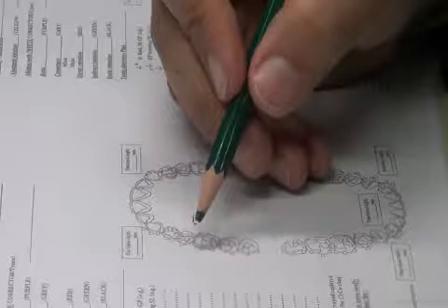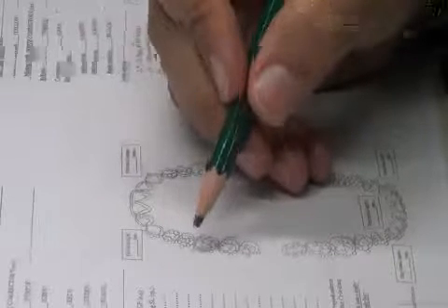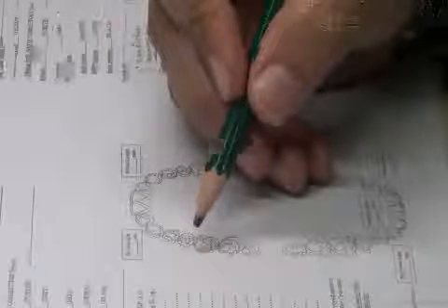What is a suitable undercut? Let's go back to the definition. A suitable undercut is where I want to end my clasp suitably to serve all of the biomechanical principles. It has relations. Try to imagine it in 3D. It has 6 relations.